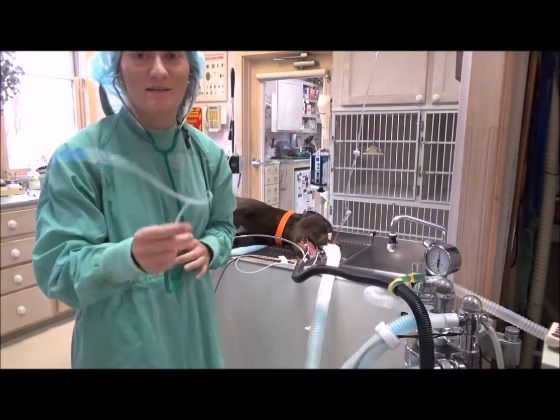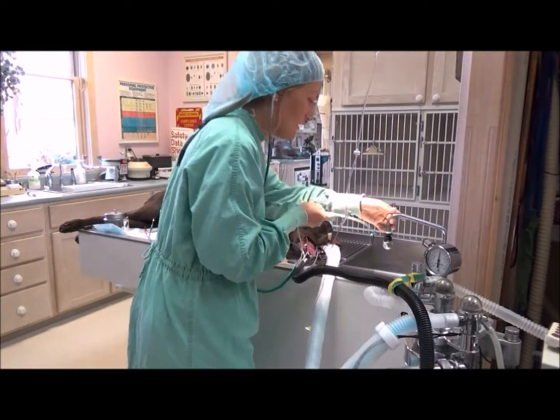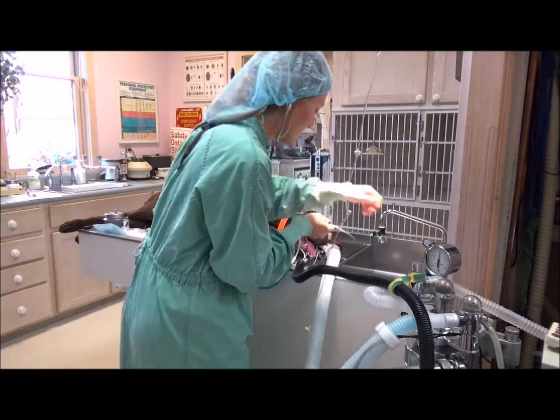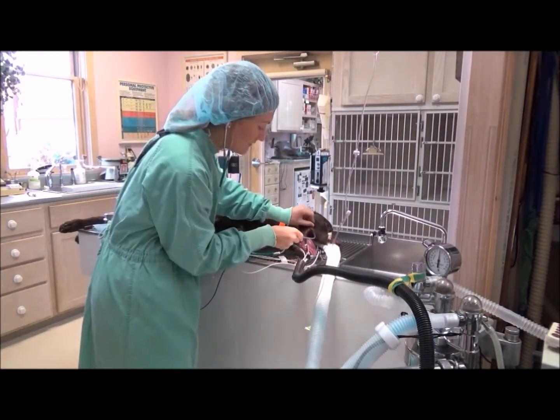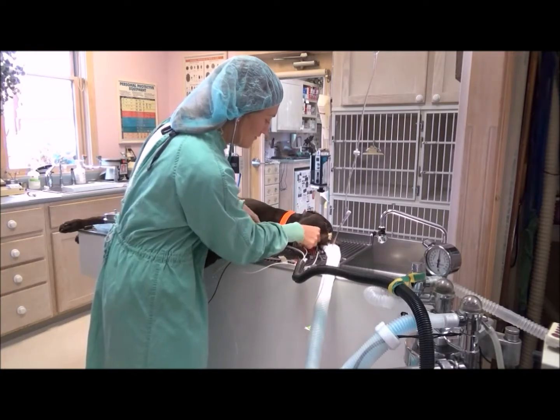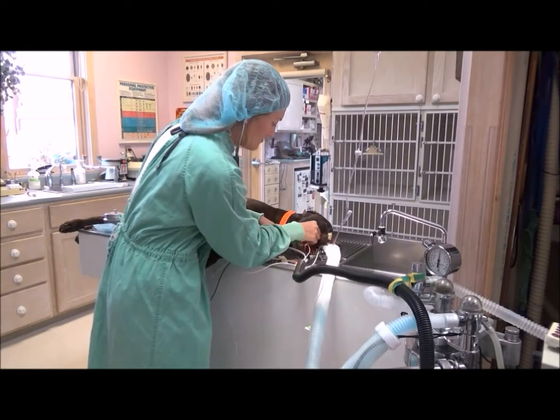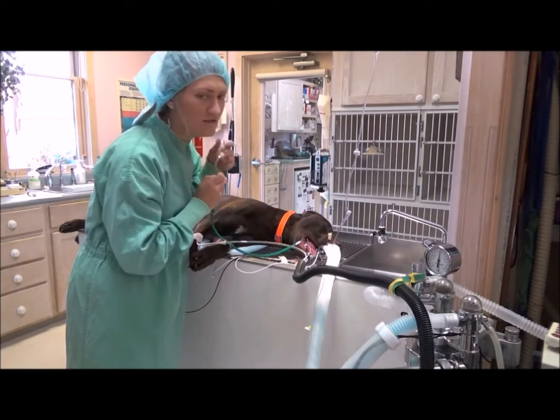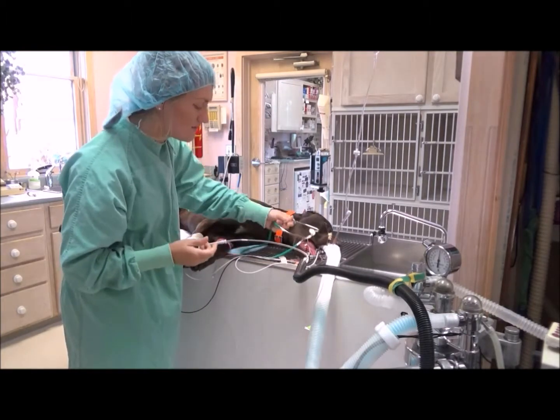Now I'm going to place an esophageal stethoscope. You have to moisten it first. And this goes in the patient's mouth, down the esophagus. And this allows you to auscultate the patient's heart.